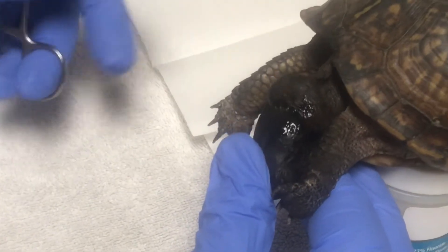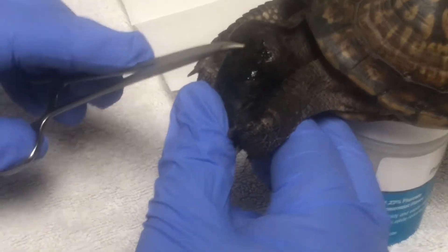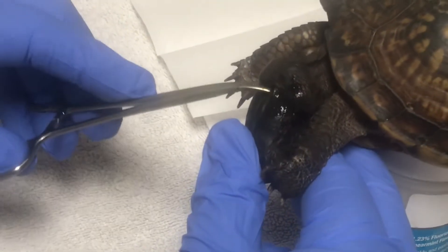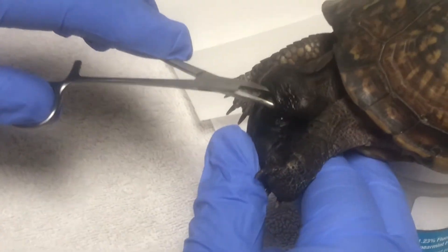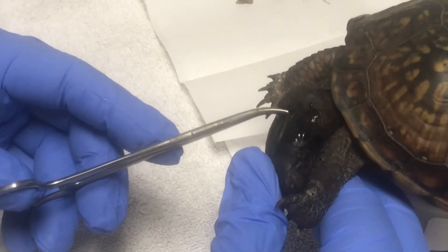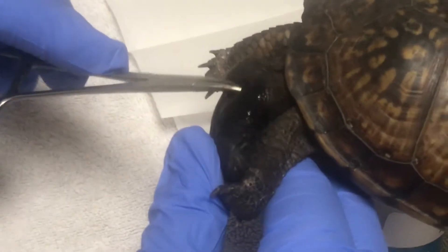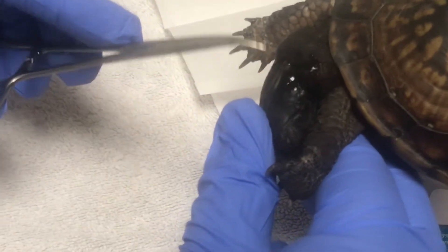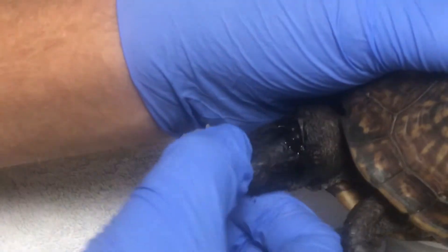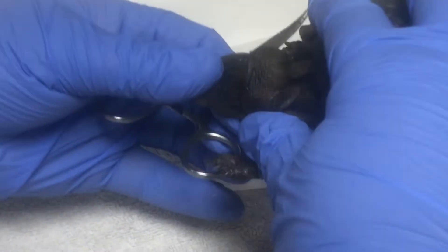Wait, I've got toe shoes on — I won't have to take my shoes off, will I? That is so cool. Just wiggle — another plus to Vibrams. Hold still. You'll be through with this in just a few moments. You're like, I'm out of here — give me my head back. If this turtle were not sedated, I would not be able to do this.